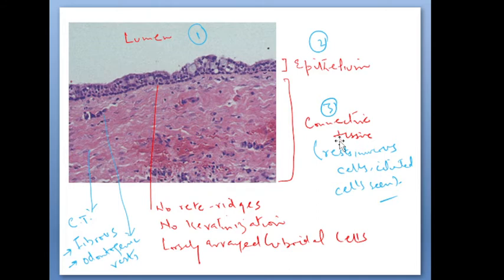The connective tissue is composed of fibrous cells, fibromyxoid. It is composed of odontogenic rest. In addition to these features, also there are mucous cells and ciliated cells seen in connective tissue.